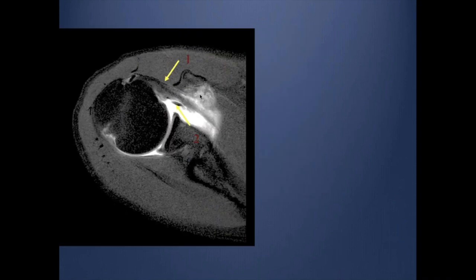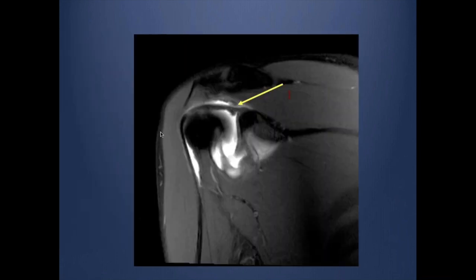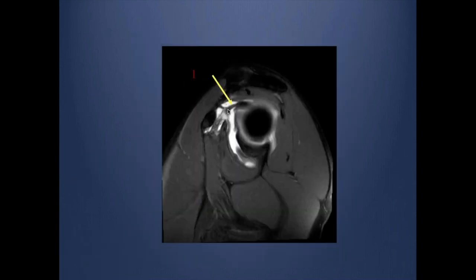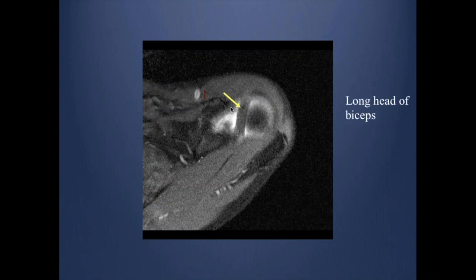More superiorly, you can see the subscapularis, and there is some structural overlap between the anterior labrum and the subscapularis — this is the middle glenohumeral ligament. You can see the glenoid hyaline cartilage beautifully. In the coronal plane, you can see the origin of the bicipital tendon from the superior labrum. In sagittal, you can see the superior glenohumeral ligament and the long head of the biceps as it crosses adjacent to the superior humeral head.